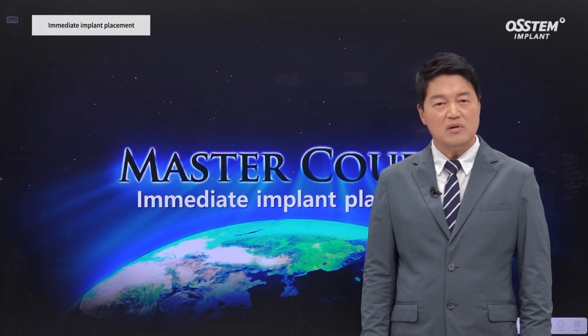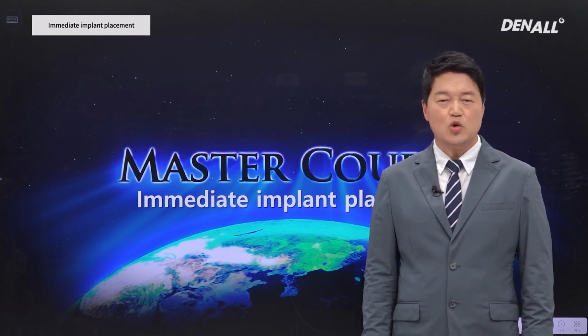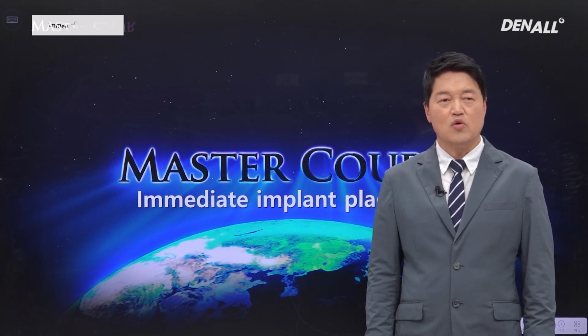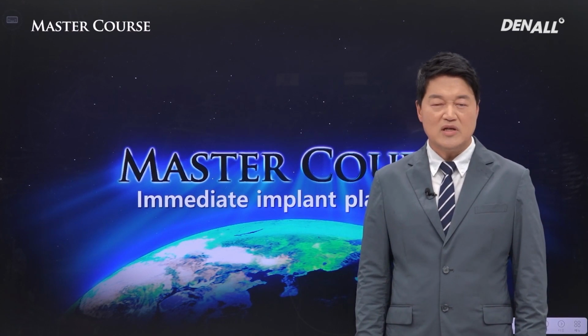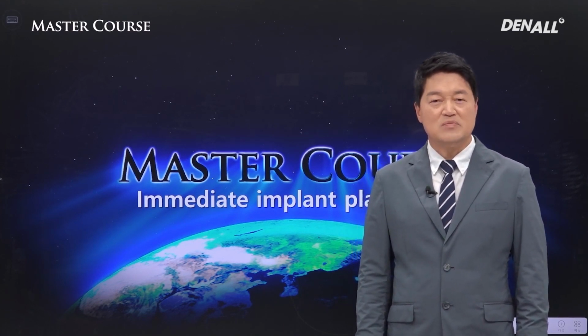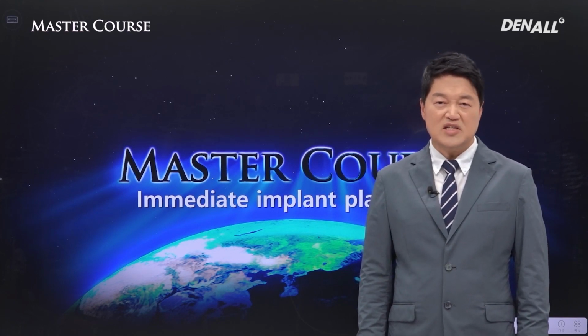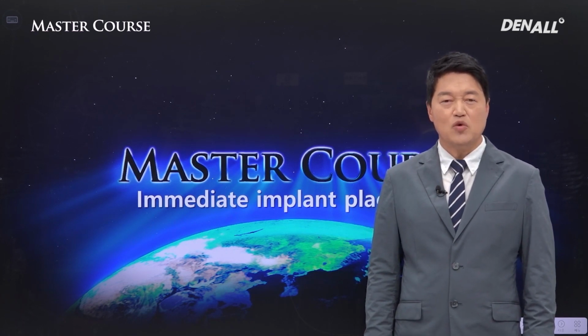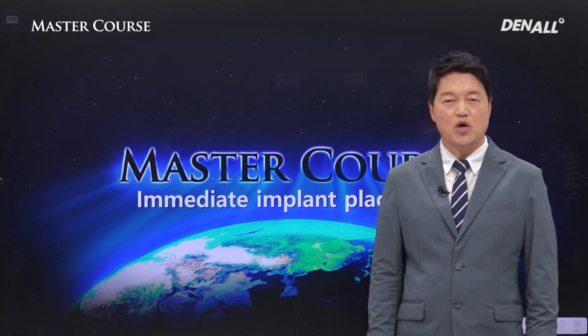Today I'm going to talk about immediate implant placement. In a nutshell, we try to do immediate implant placement after extraction. The reason being it reduces treatment time and it is a one-stage surgery, so patients really like it. If possible, immediate implant placement is attempted, but this cannot be done for all cases.